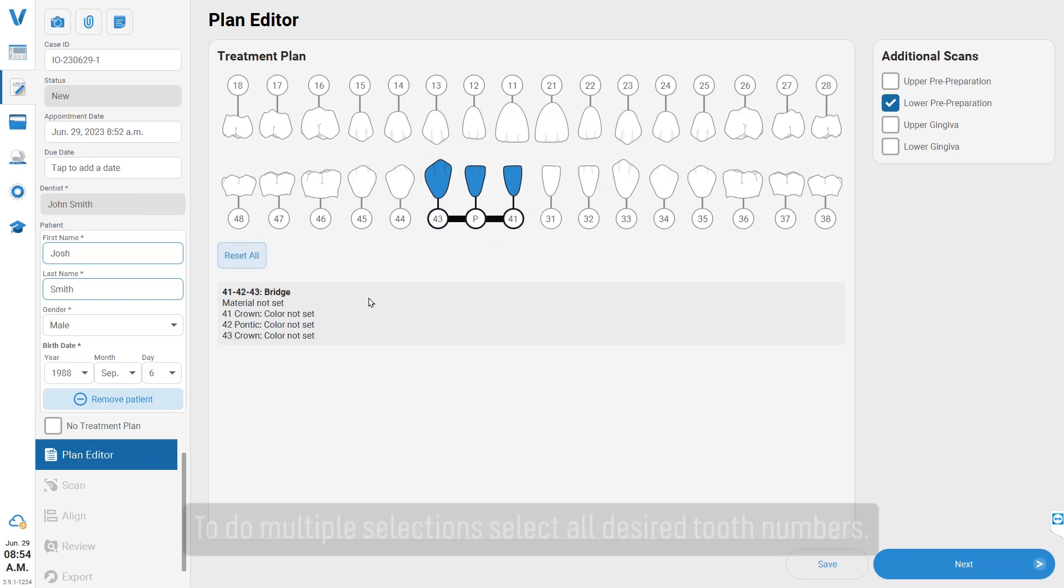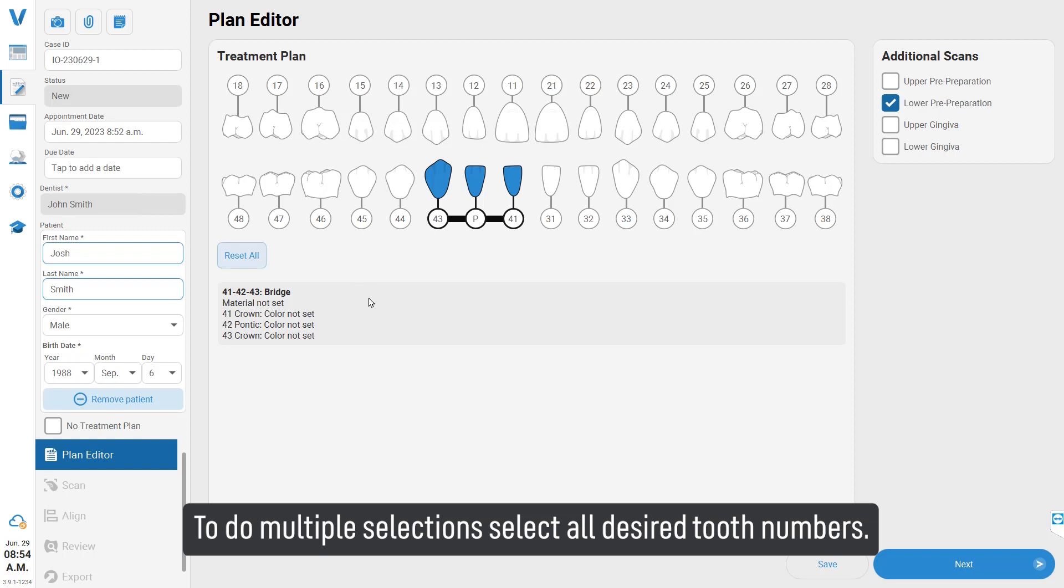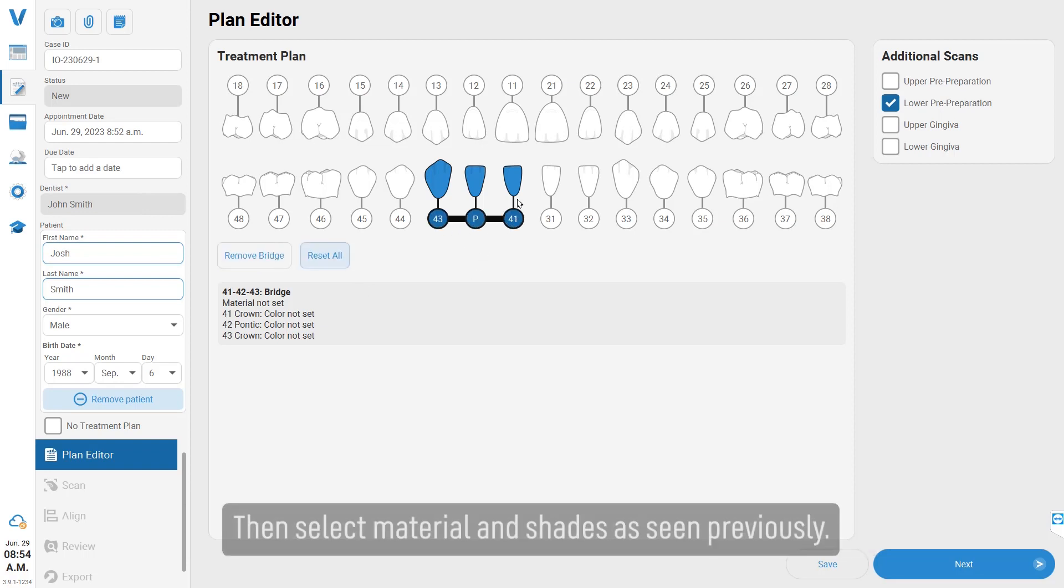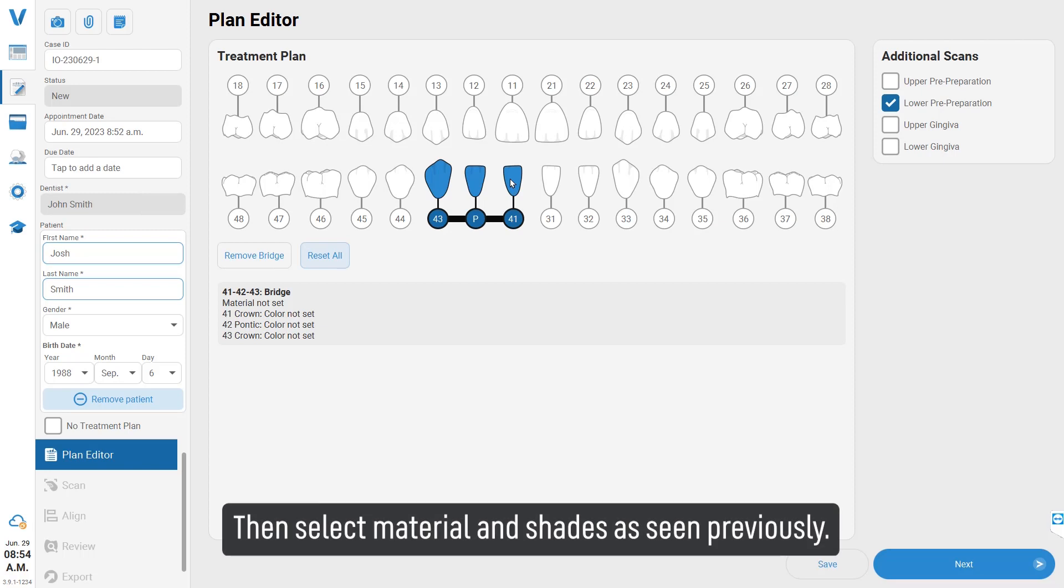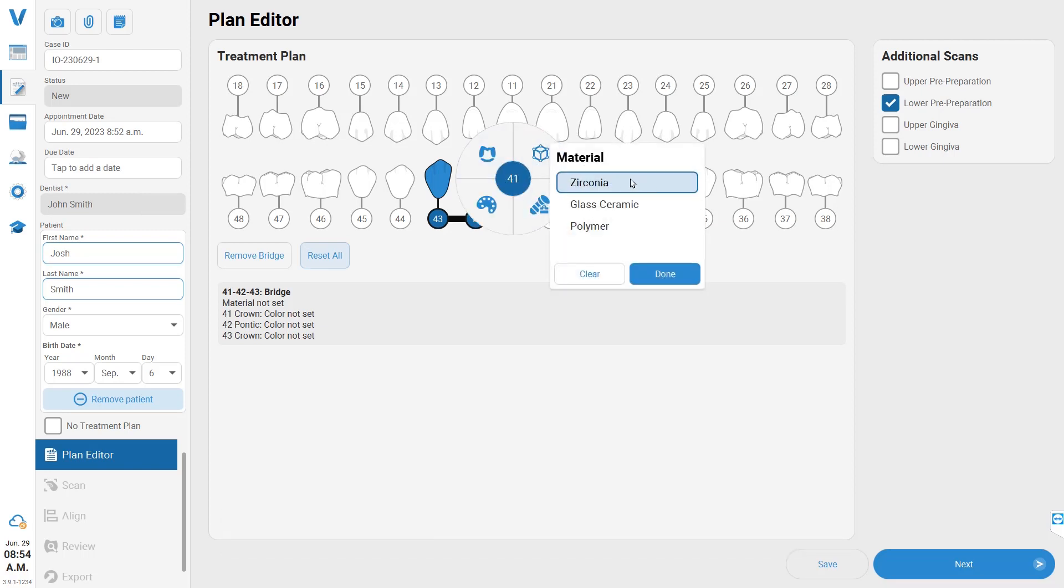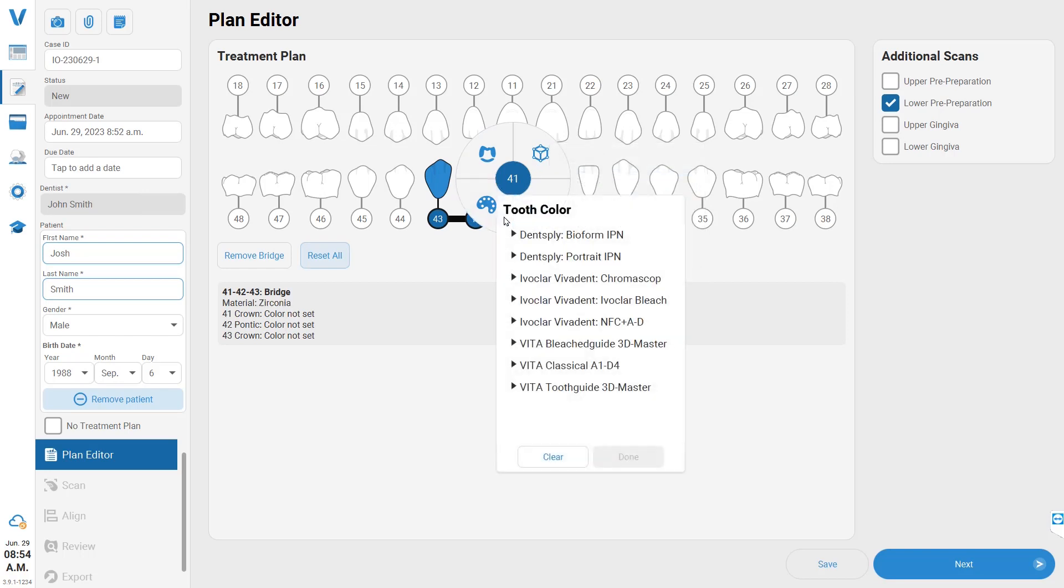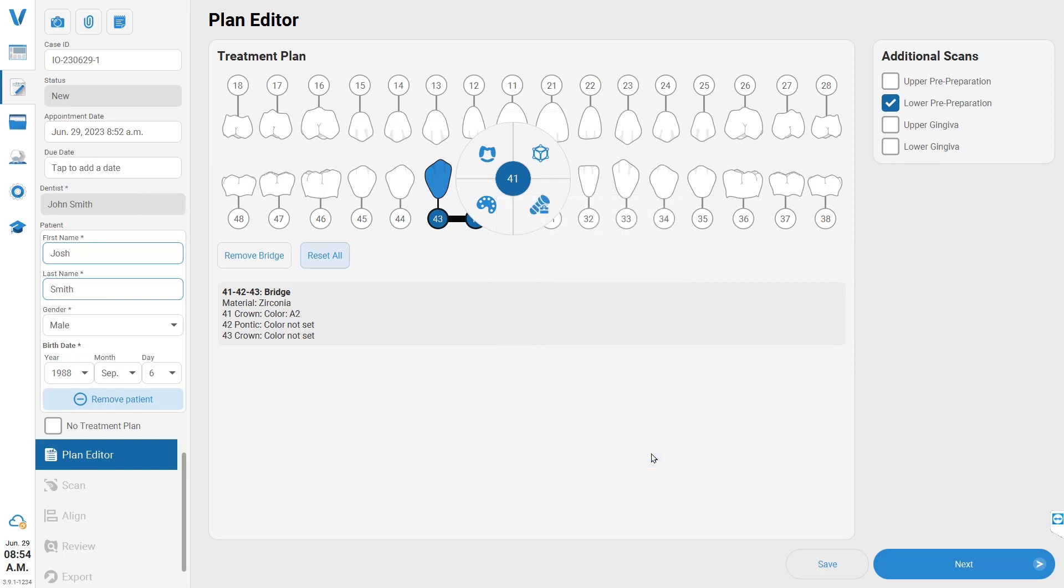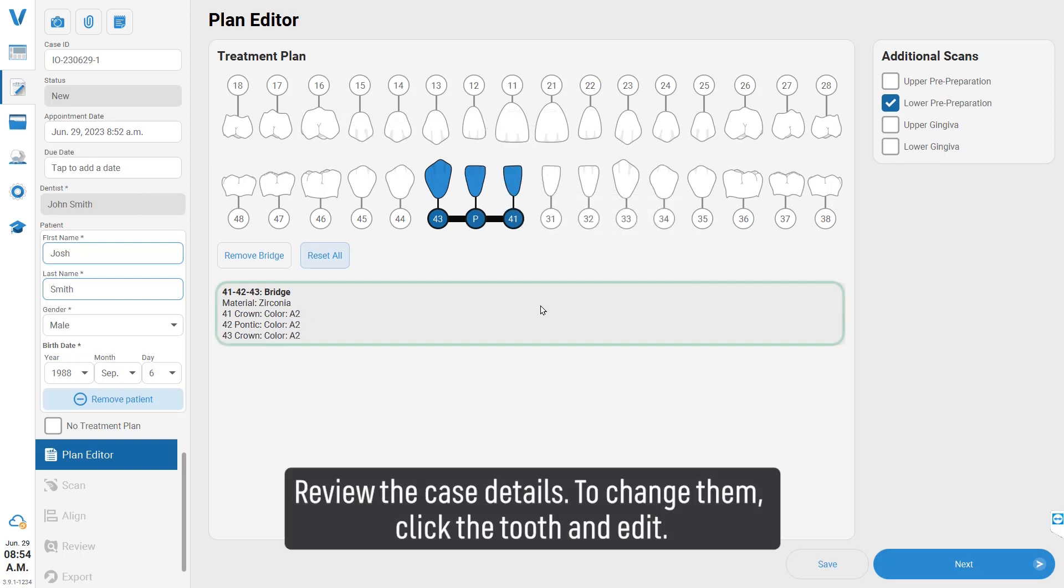To do multiple selections, select all desired tooth numbers, then select material and shades as seen previously. Review the case details.